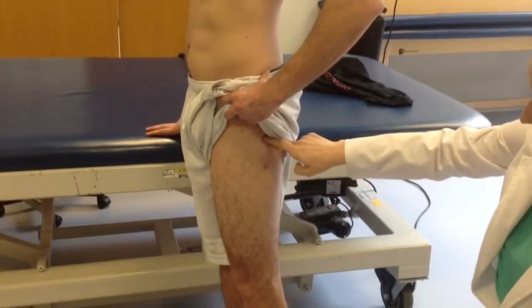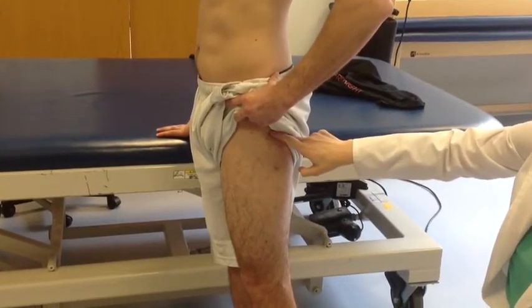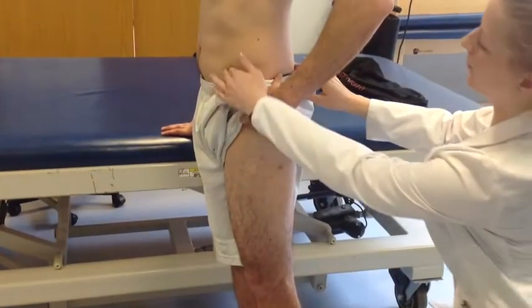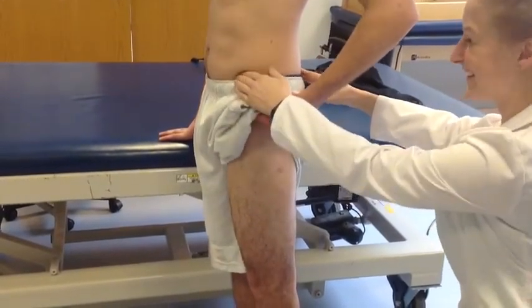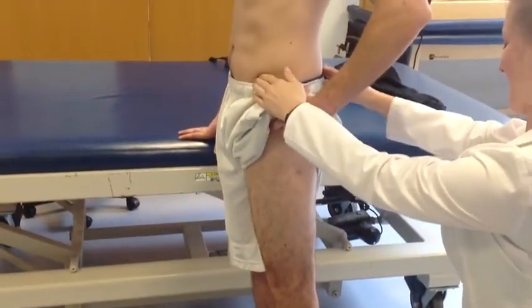Ask the patient to raise their leg up toward their chest, maintaining the landmarks and looking for compensations, palpating both the ASIS and PSIS. When the ASIS starts to move into your finger or the PSIS starts to move, the patient is no longer performing isolated hip flexion.